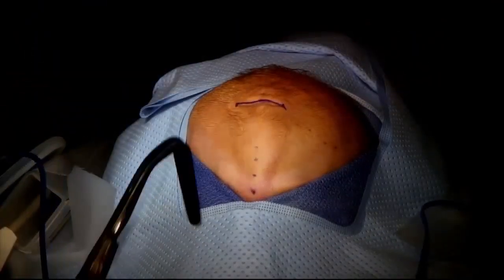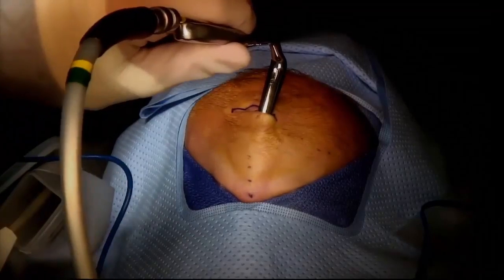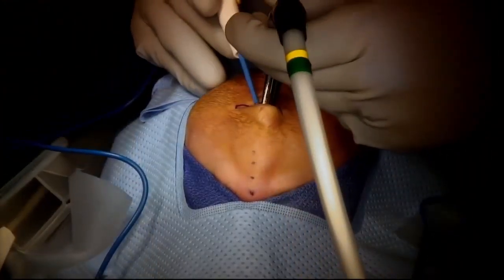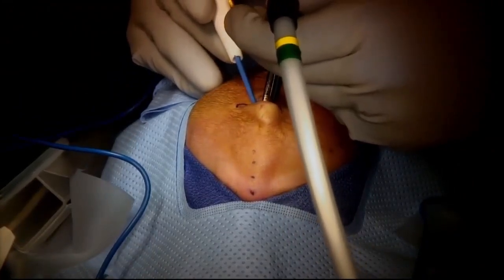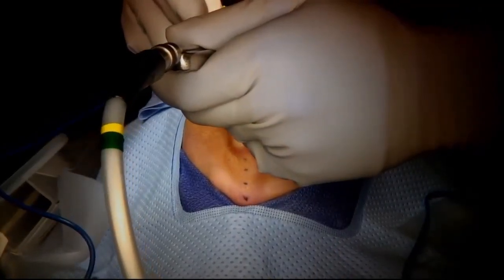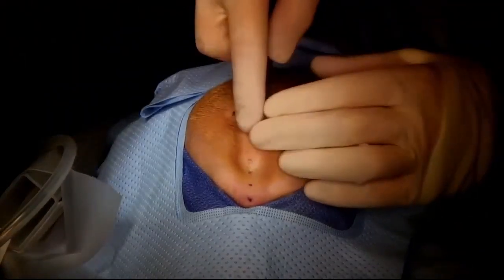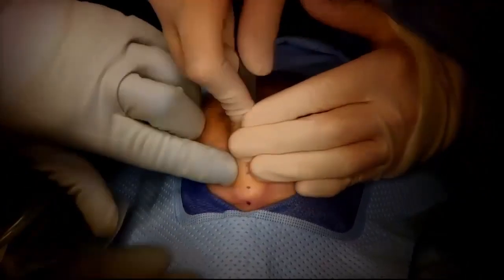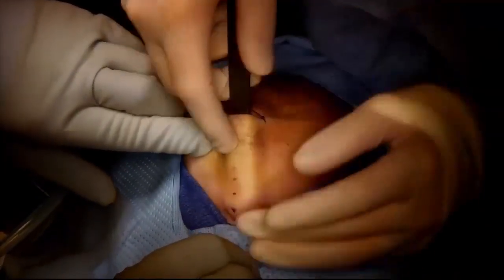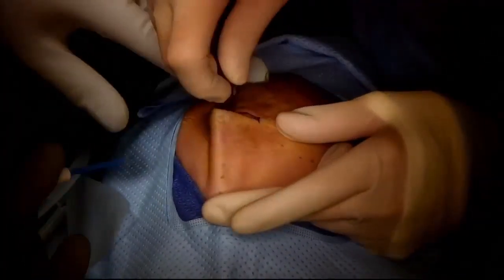With the assistance of a rhinoplasty lighted retractor, the subgaleal plane is then developed towards the mid-forehead, also using the needle tip Bovie to aid in a bloodless subgaleal plane dissection. This plane is fully developed down to the nasion using insulated brain ribbon retractors. The brain retractor is slowly and carefully advanced to reach the nasofrontal suture as shown here.